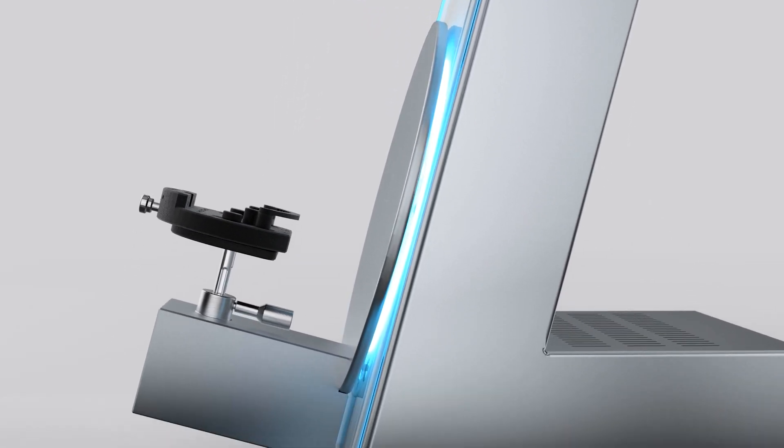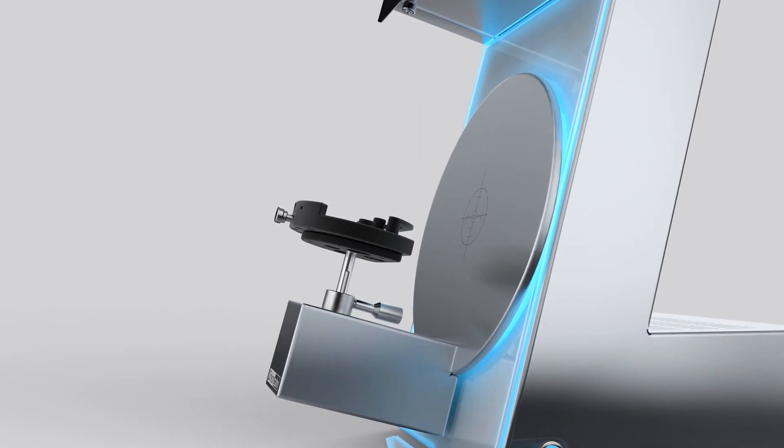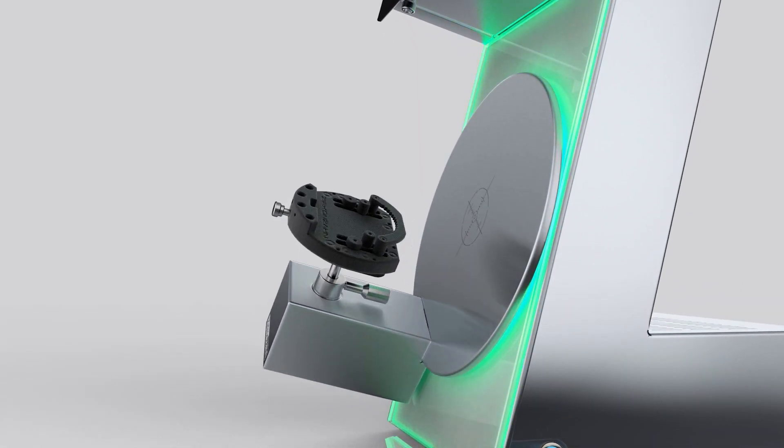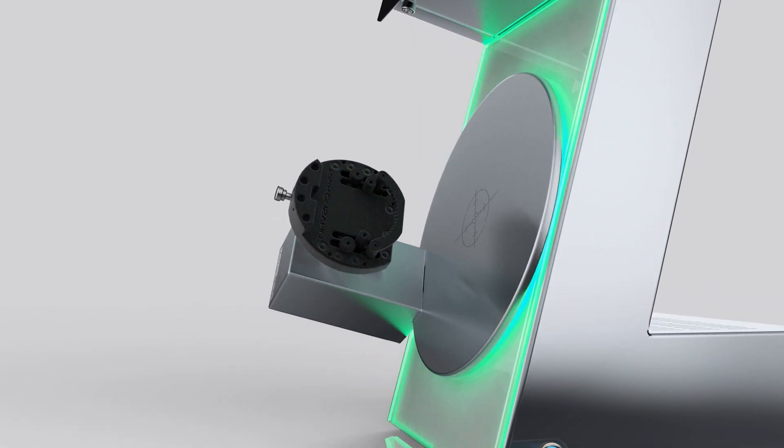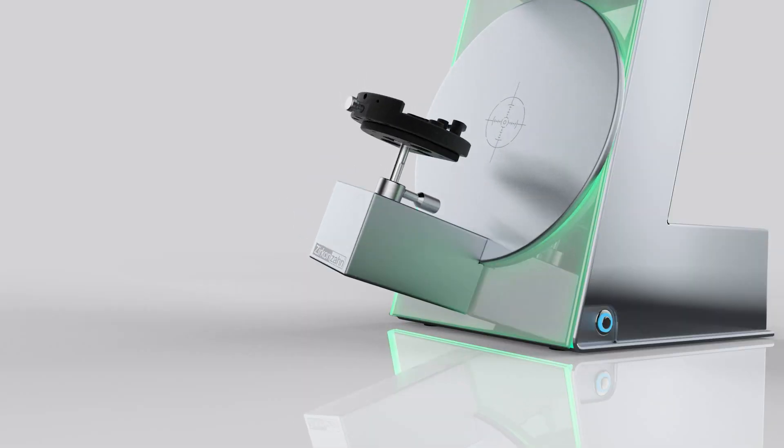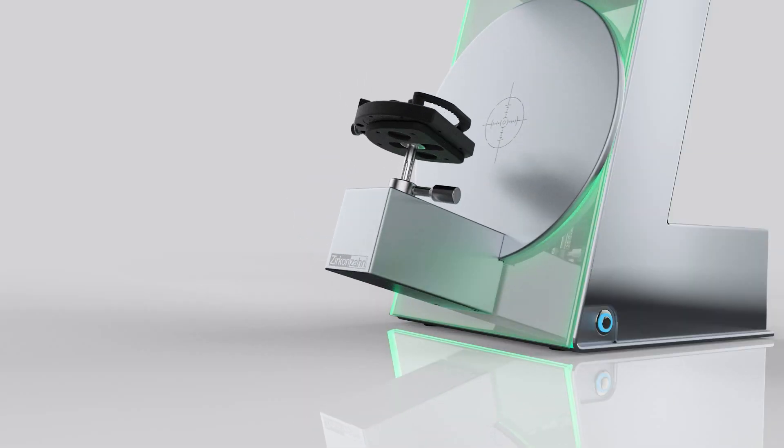The open platform and the large scanning area permit easy positioning of models and articulators, which can then be digitized in a single scanning process.